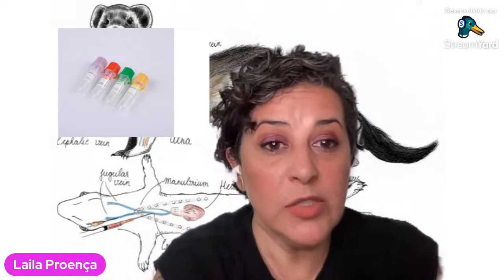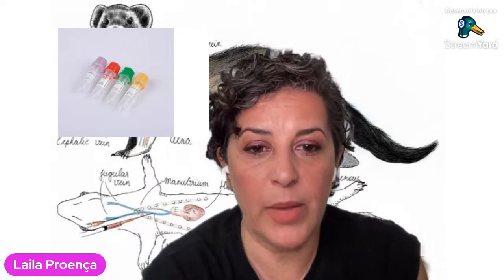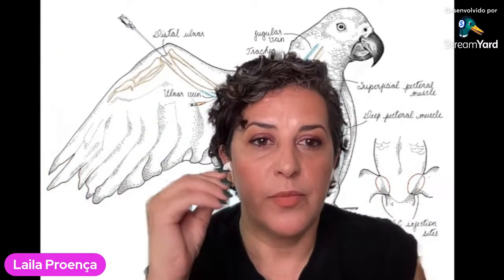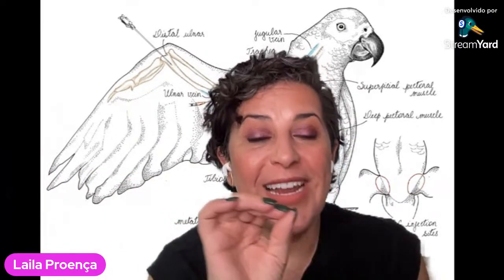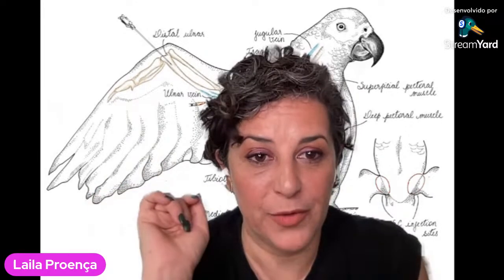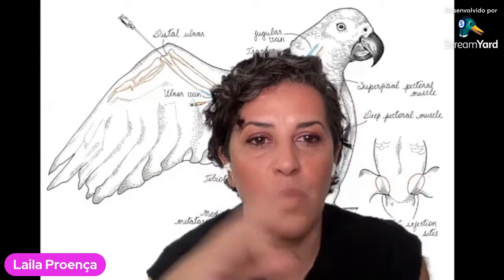Very easy, correct? When it comes to birds, it's going to be the same thing that we do for mammals. Say we're collecting from a parrot: for CBCs we use EDTA, and for biochemistry we use heparin or the serum separator, except for crows. Crows are different. Their blood hemolyzes with EDTA, so we need to use heparin for them. You guys get it? I'm only talking to you about pets. Of course, there are exceptions when we talk about wild birds, but for pet birds, crows are usually the only ones we're going to encounter that require a different type of anticoagulant.